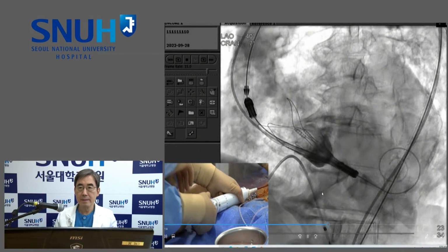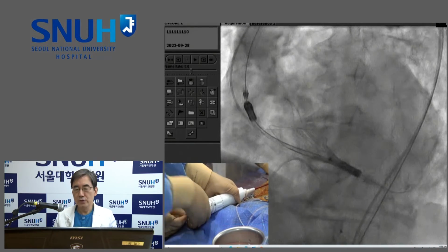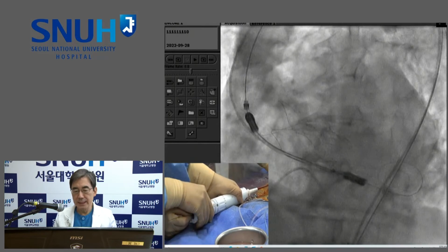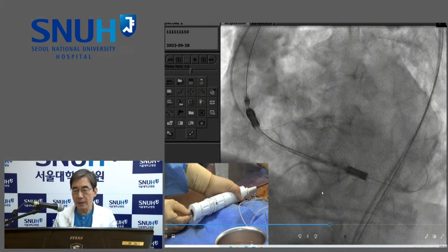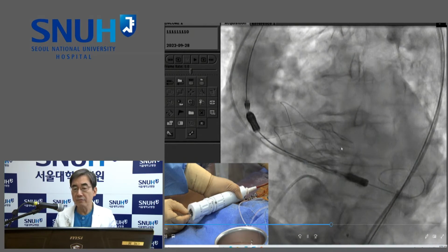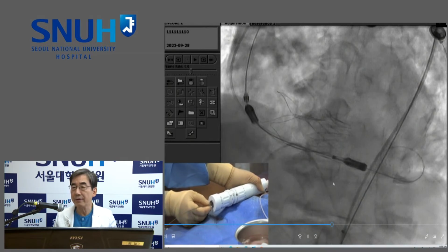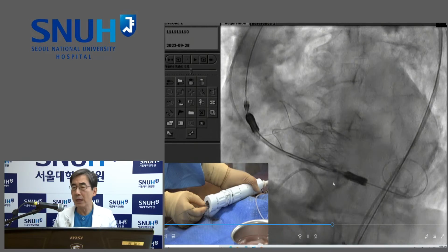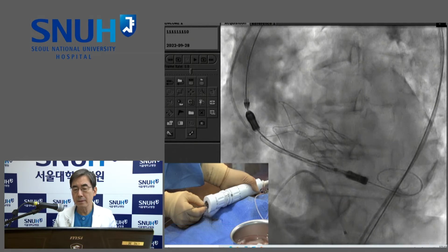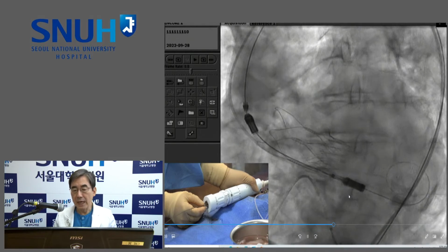During implantation, is rapid pacing mandatory? No, just for pre-ballooning. The beauty of the Accurate Neo system is very stable hemodynamics during deployment, because upper crown deployment and stabilization arch deployment do not affect the hemodynamics. And the final lower crown deployment process is very rapid, like Sapien, without any pacing. Okay. It looks so stable in this video, right? Then I remove the whole system.